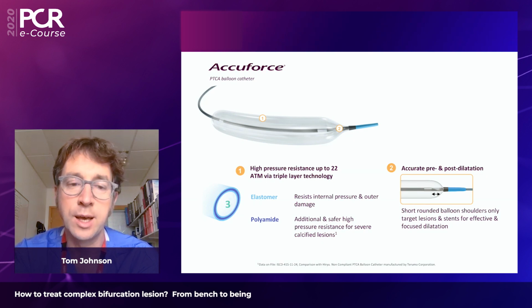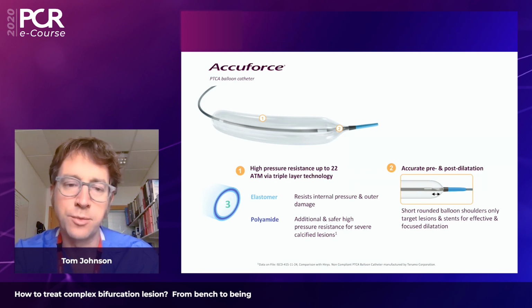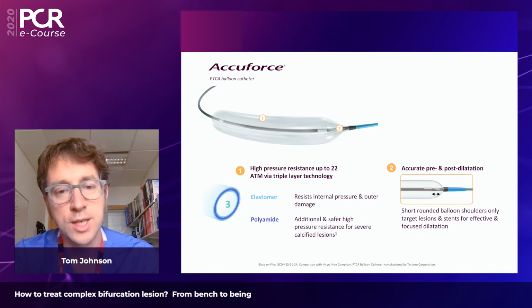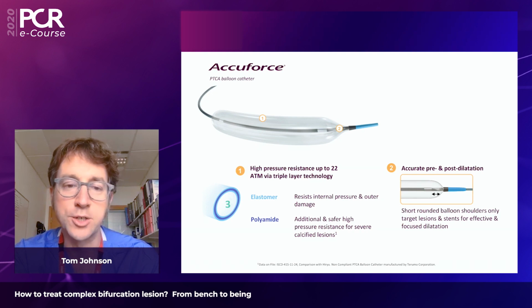So trying to minimize really any potential injury distal to the stent, and then most importantly during the POT, not wanting to distort the true carina with then potential impingement or narrowing of the side branch ostium. So again, hopefully by simulation, we will be able to demonstrate these key features, both of the balloon and stent design. So with that, we'll hand over to Thierry to demonstrate the educational benefit of the benchtop simulations.